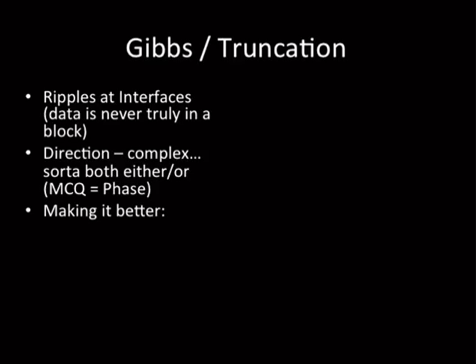If prompted, I would say the cause is limited sampling of free induction decay. That's what you actually read in physics books. It can be seen in both the frequency encoding and phase encoding direction, but it's more classically seen in the phase encoding because many times a phase encoding matrix is smaller than the readout matrix. That's the one that's selected to reduce time.